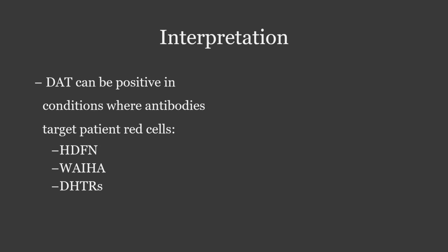If you're evaluating a transfusion reaction, a positive DAT on the post-transfusion sample indicates the reaction could be due to a clinically significant antibody. For a patient with anemia and spherocytosis, a positive DAT can identify the cause of the patient's anemia. A positive IAT anywhere along the line in pre-transfusion testing indicates an incompatible donor-recipient combination.